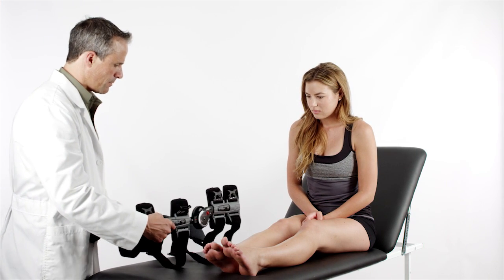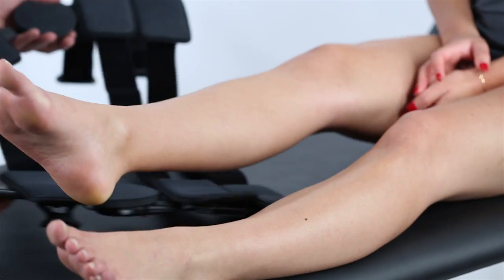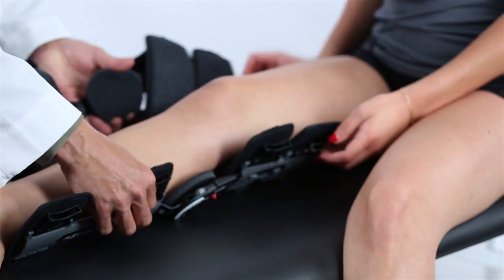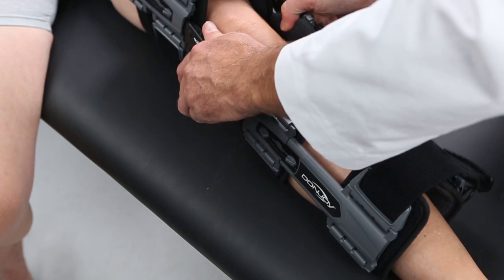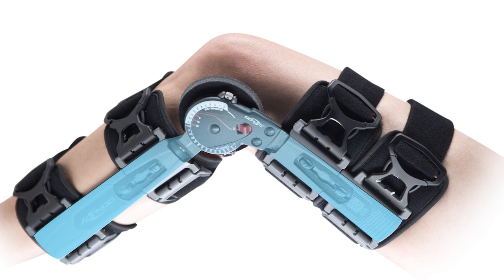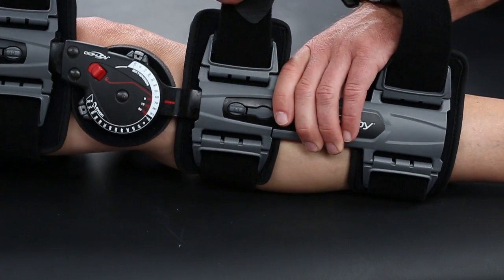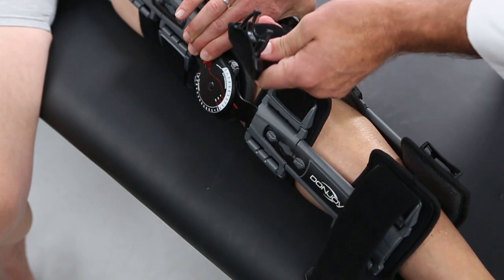Once you're familiar with the Exact's different features, it's much easier to apply and adjust the brace. When you're ready, place the patient's leg on top of the flat brace and apply the shorter upright to the thigh. Then adjust the brace until each upright is aligned to the center line of the medial and lateral sides of the patient's leg. Adjust the strap lengths one by one to remove the slack from the posterior aspect of the brace.